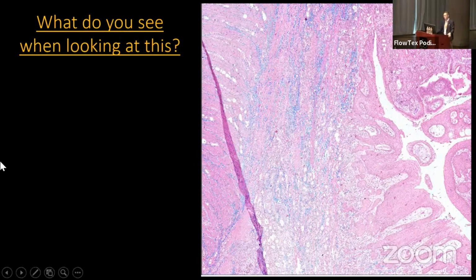This is an H&E tissue. Basically, it's a slice of tissue taken from a patient, stained with two dyes that allow you to see individual cells within the tissue. And for me, just one person, I can have multiple perspectives on this in terms of how or what I analyze about just this image.